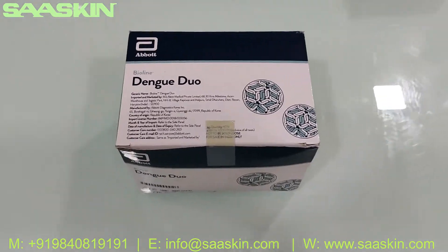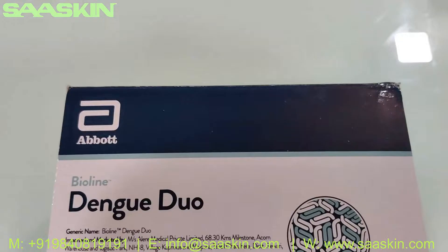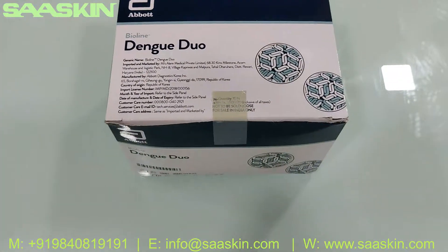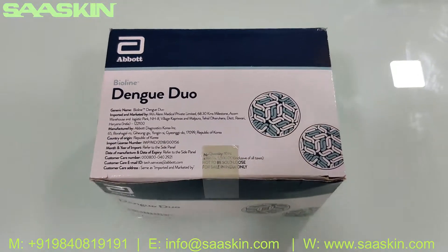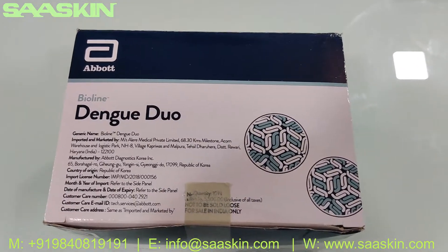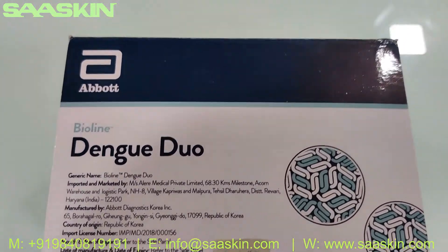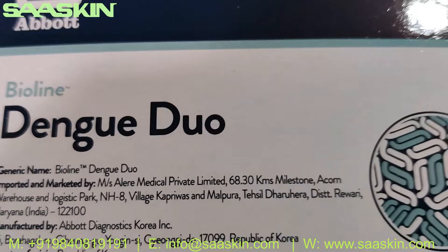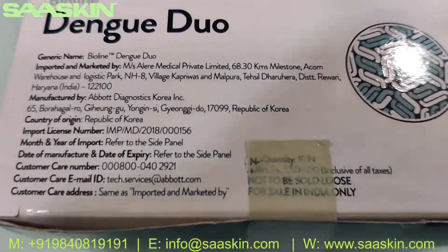Hello everybody, today we're going to see the unboxing of the Abbott version of BioLine Dengue Duo test kit. The previous SD BioLine has been revised and completely rebranded to Abbott. This product is called the Abbott BioLine Dengue Duo test kit.